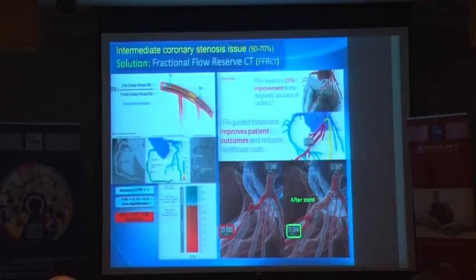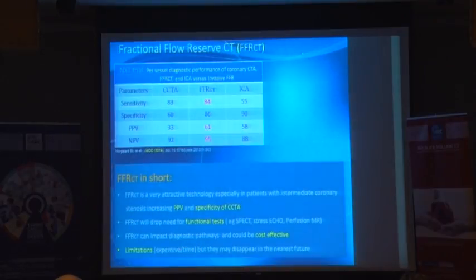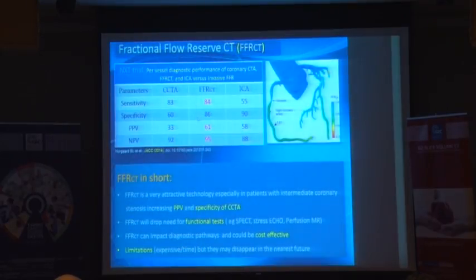So it got normal. So this FFR-CT technique is coming, very promising, greatly increasing the sensitivity and specificity in regards to CT alone. If we're speaking of CT alone, we have a lower specificity. If we combine it with FFR technique, we increase our specificity, and we get very near to the numbers of interventional angio.